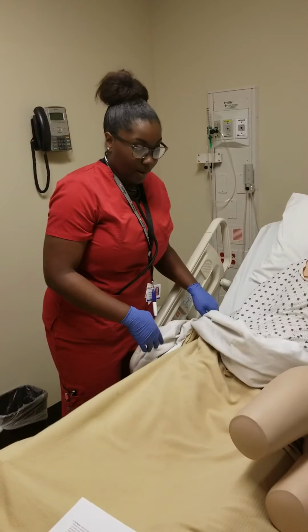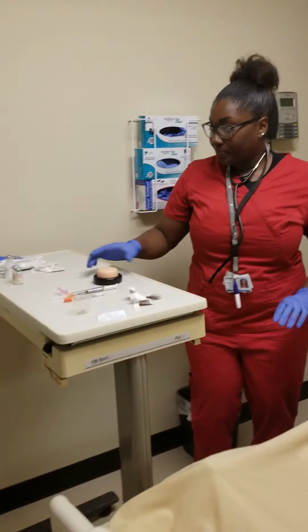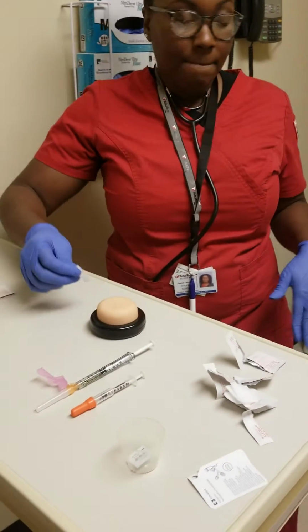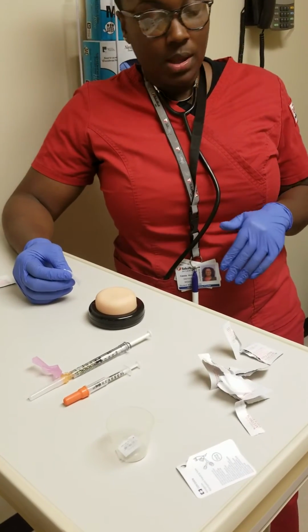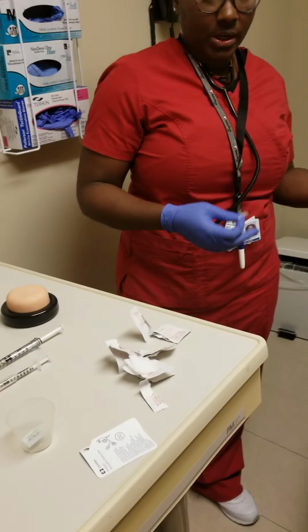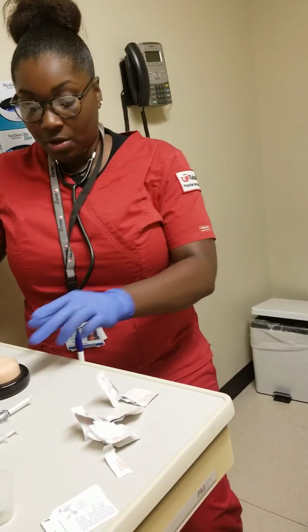So, I won't inject my patient. I will demonstrate on here, as if this was the patient, and I will be giving the medication on their abdomen. I will review the chart again, make sure everything's correct with the order, the patient name, and I will also ask the patient where the last place they were injected was, because I want to alternate so that it helps the area heal.